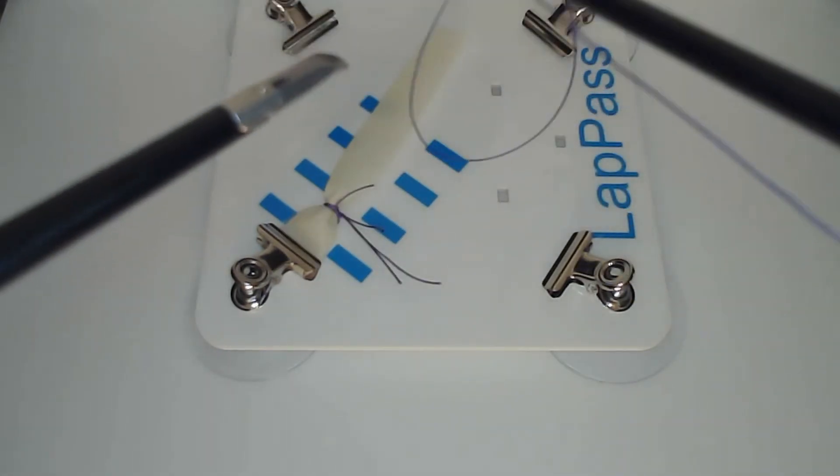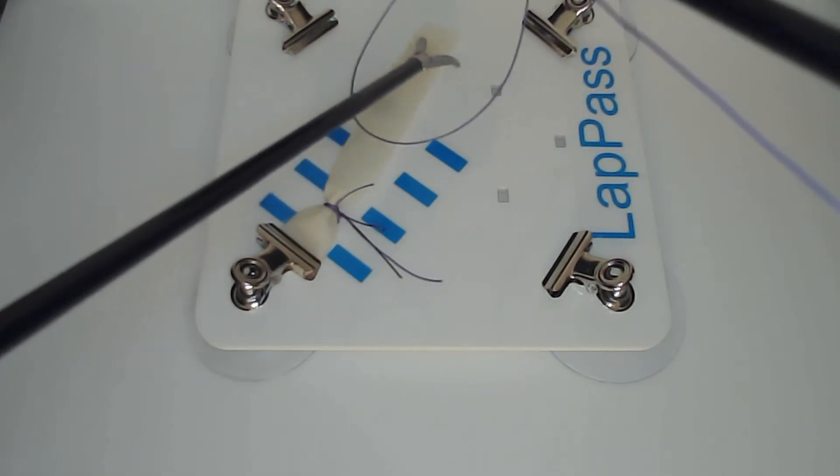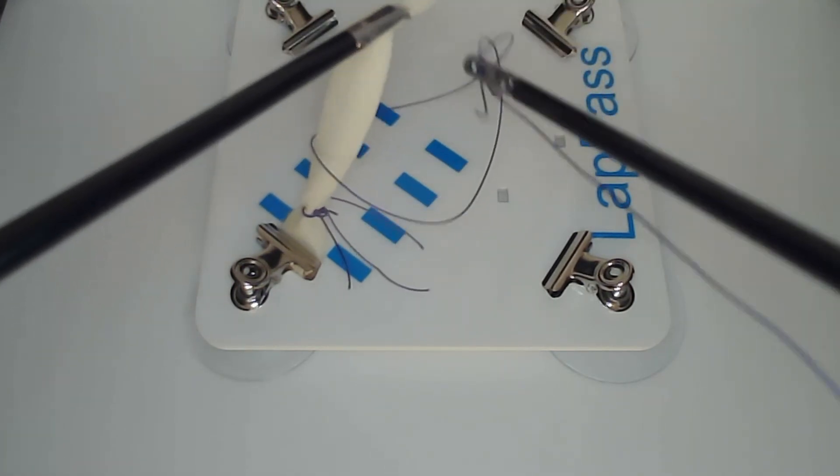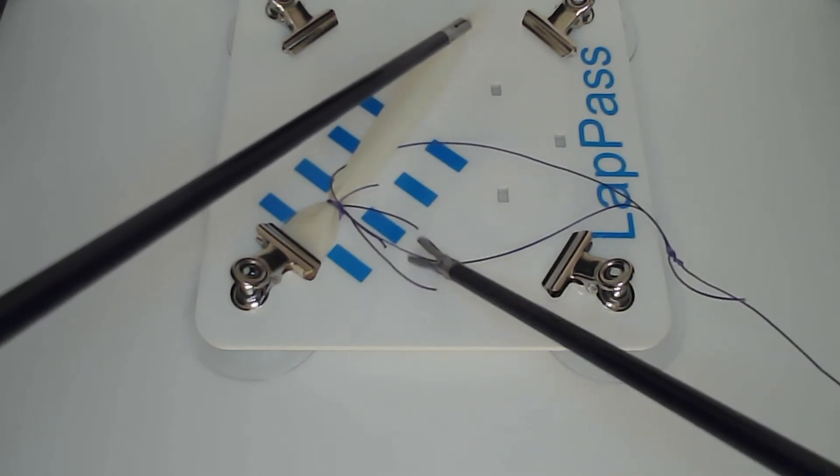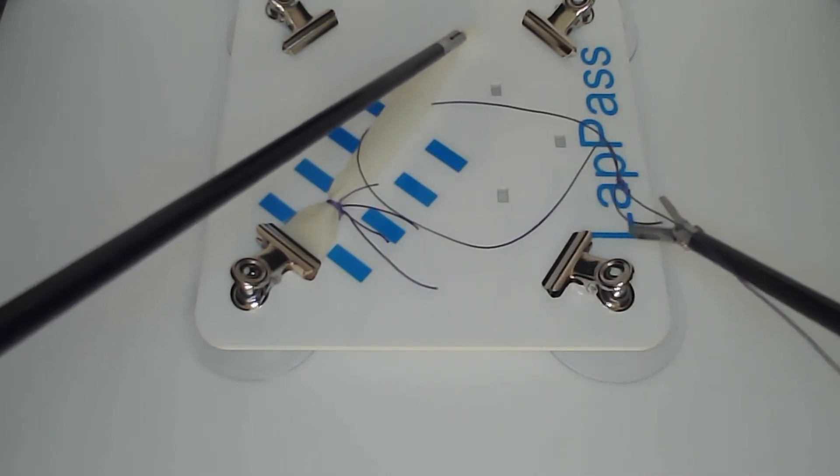It's important to use the instruments bilaterally. You can either use two Johans or, as demonstrated here, a Johan and a dissector.